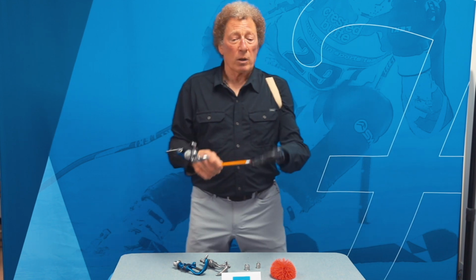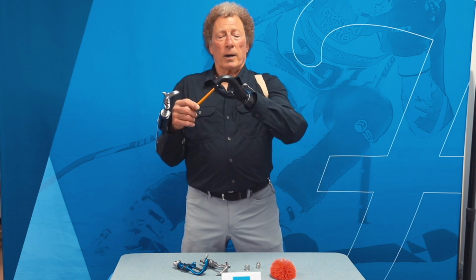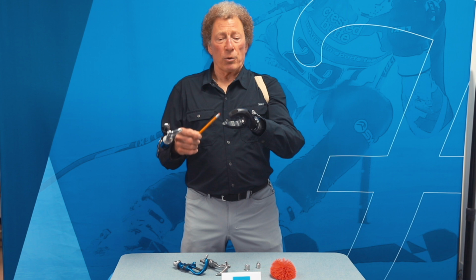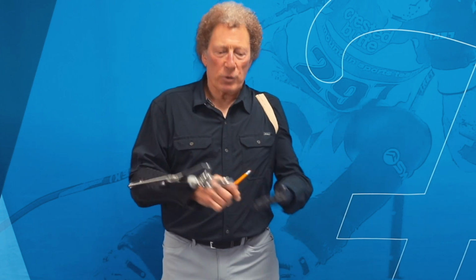It's completely wrong. It's just not accurate at all. Voluntary closing devices take very little energy to operate, about 3 pounds of energy to close. It works much like a hand brake on a bicycle. You squeeze on the bike brake lever and you get more force at the brake calipers. The harder you squeeze the lever, the more force you get, and you can feel that resistance in the lever.